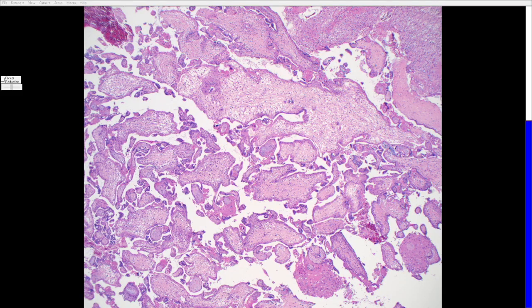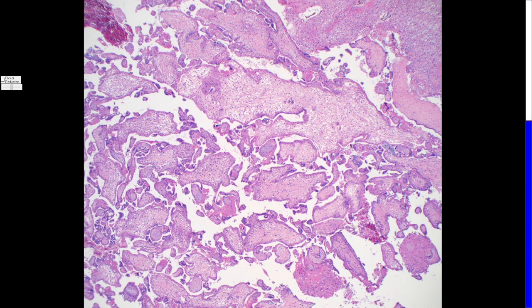So we're going to start with this case of trisomy 11. So we know this is not a mole, even though you may consider a partial mole. And again, features are very subtle, so don't worry if you can't get them at first. It takes a lot of experience at looking at POC to see any of those changes. So these are dysmorphic villi, in my opinion. And what makes them dysmorphic?